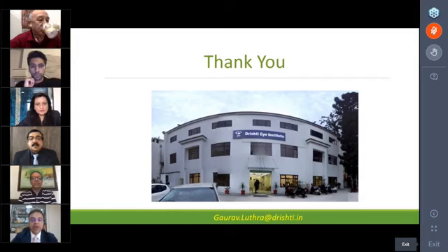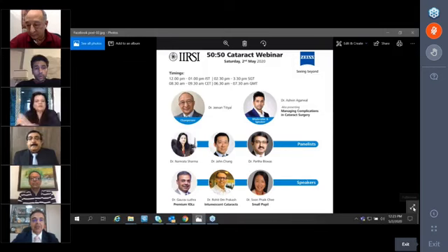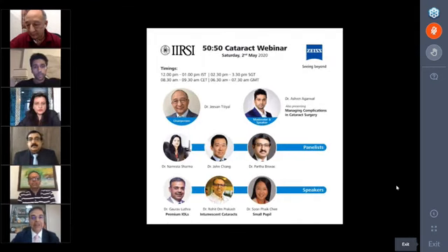Ashwin, I would like to add that we never had all these devices, and we've been doing premium IOLs for 15 years. It's just that we got better. So the take-home message should not be that you must do these things to get a good outcome. Even if you don't have an optical biometer, you can invest a couple of lakhs into a small, better keratometry device and get a good ultrasonic immersion scan. You can still do it. Of course, the newer devices make life much easier and better. Yet you can still achieve 90% good outcomes even with very basic devices. That should be the take-home message, so that it doesn't discourage our viewers who don't have these devices from going on to do these things.